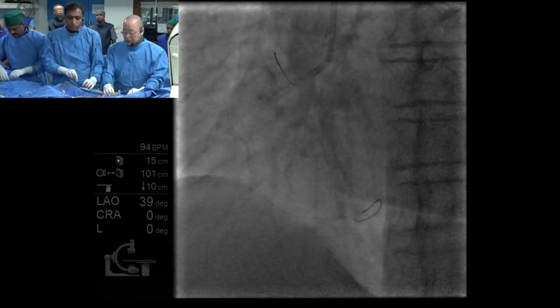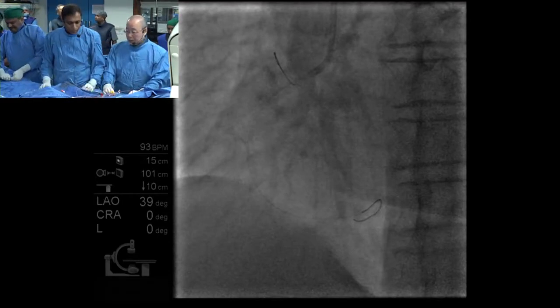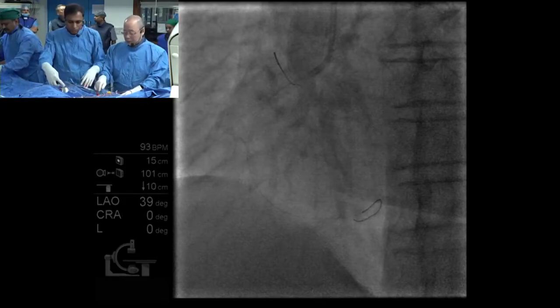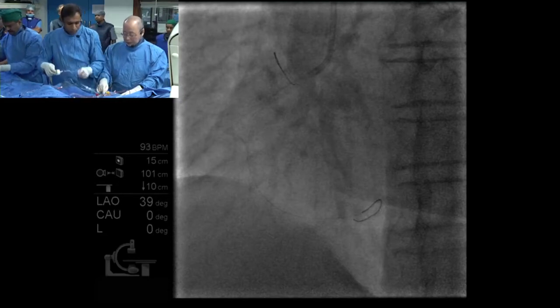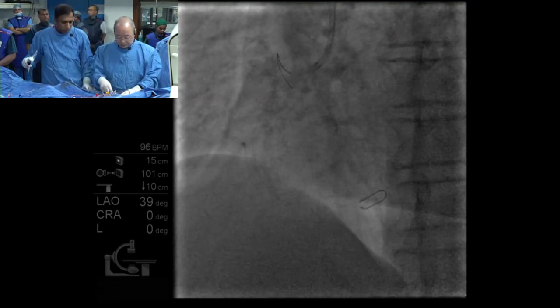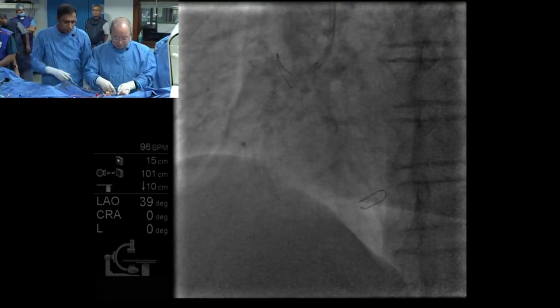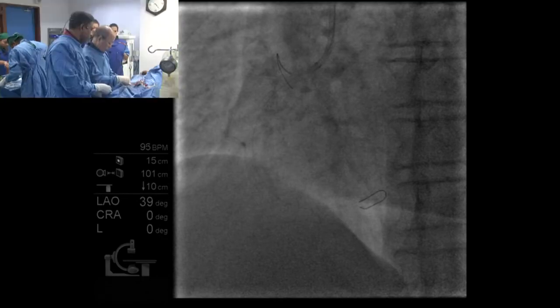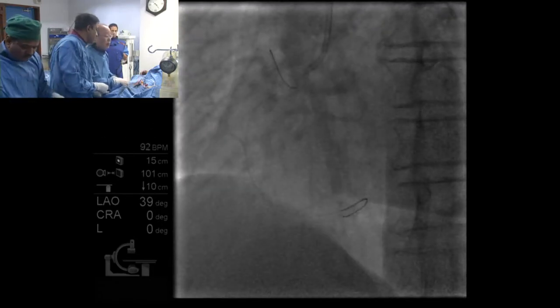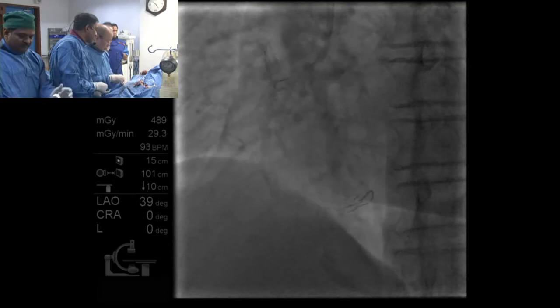Okay, so take this balloon out, and I want to dilate by using this balloon. Comments from the panel on your antegrade microcatheter? I mean, there's no perfect microcatheter. Do you have any particular comments to make? So Dr. Saito, you take the anchor balloon out.